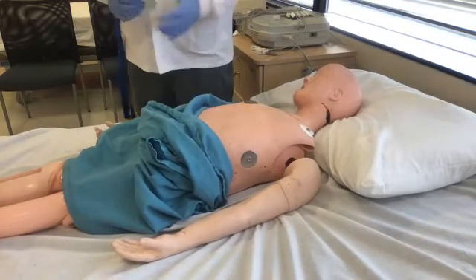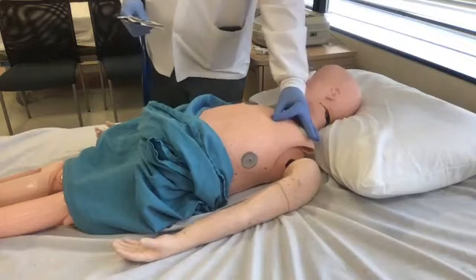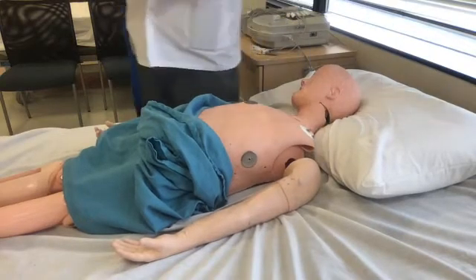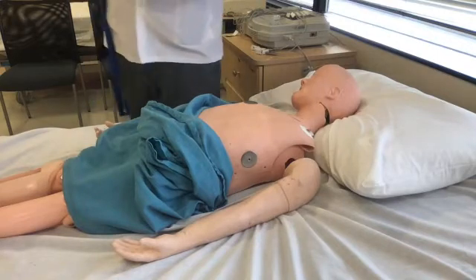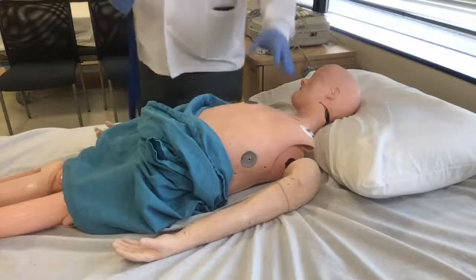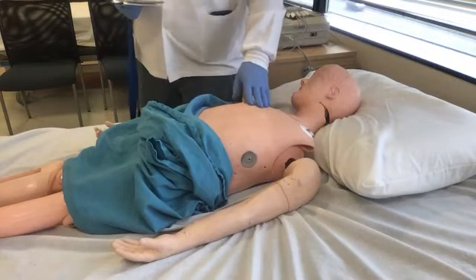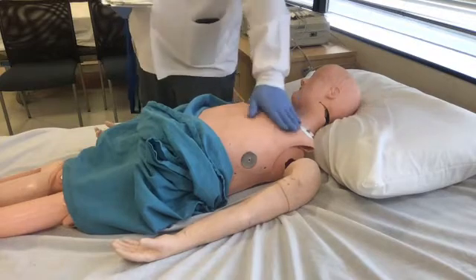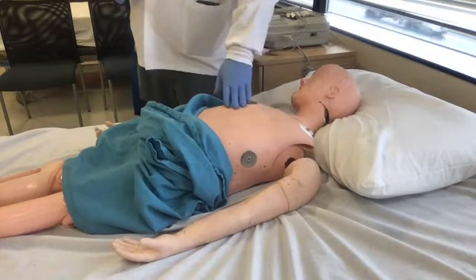And then when the isopropyl alcohol dries off, go like this again, then this should stick. And another thing is, many cultures love oils. So if you're palpating your patient and you're looking at your patient and they're shiny, take that 70% isopropyl alcohol and wipe the areas that you need to wipe.